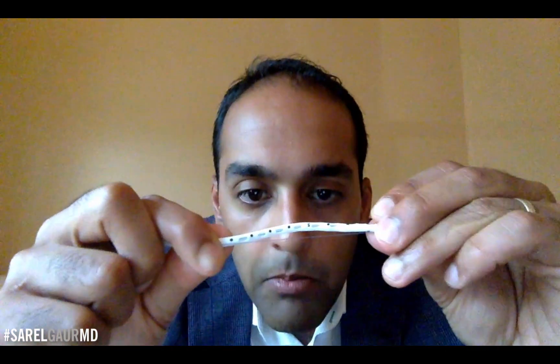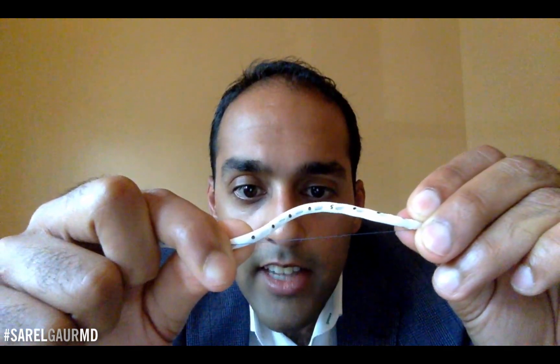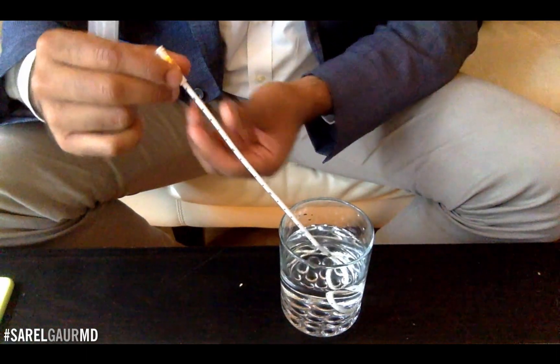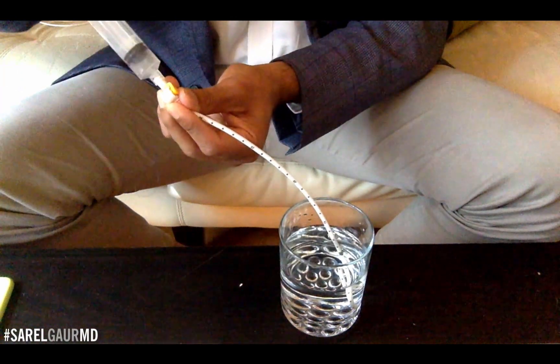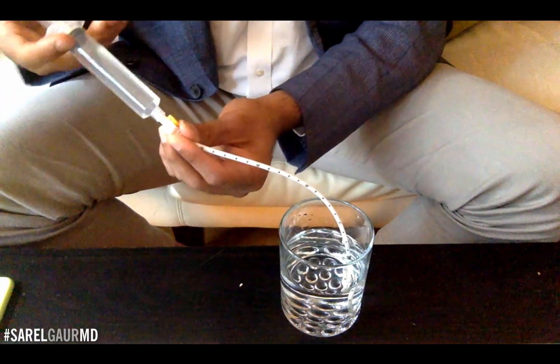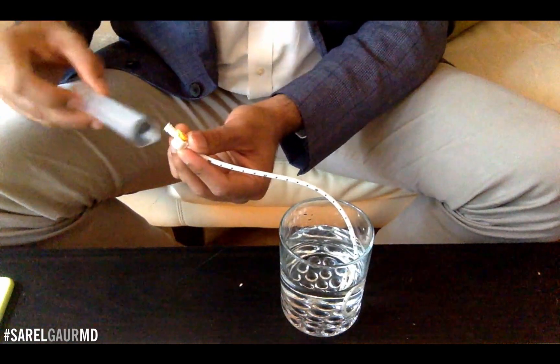I forgot to mention something on this catheter — I'm going to uncoil it a bit here. These are the most important portions of the catheter. These are the holes of the catheter, the side holes. That is actually what provides functionality for the catheter. Imagine this water in this cup is a large fluid collection with the catheter in position. Using those side holes, I can basically drain that fluid collection — I can very easily get fluid out of the glass through those side holes. That's the whole goal of the drainage catheter: to take fluid inside the body and drain it outside.